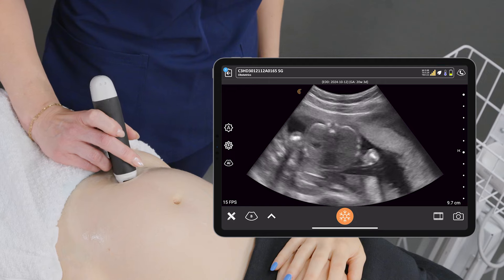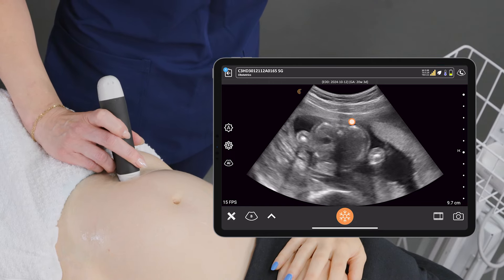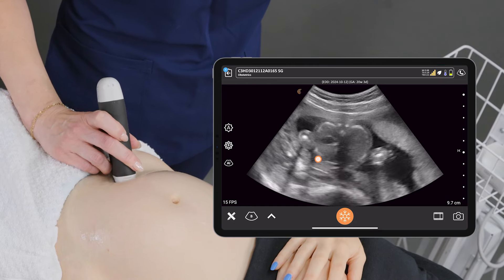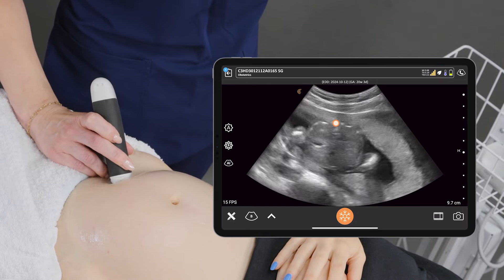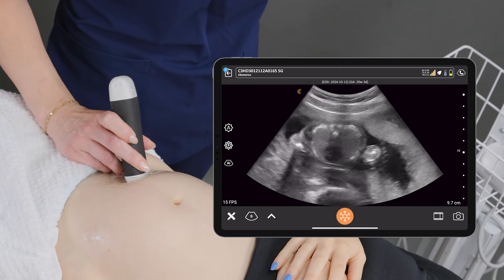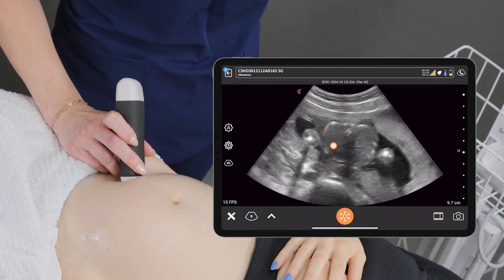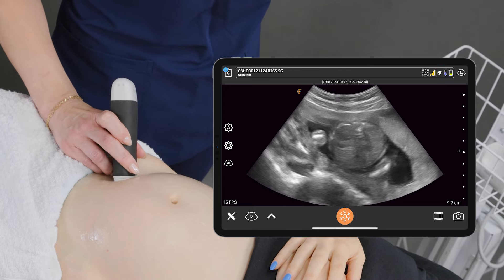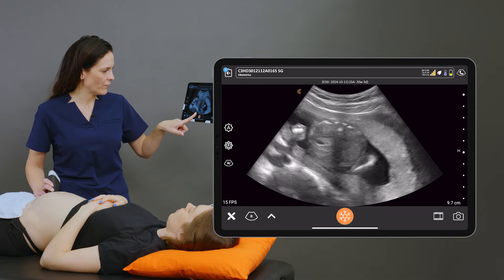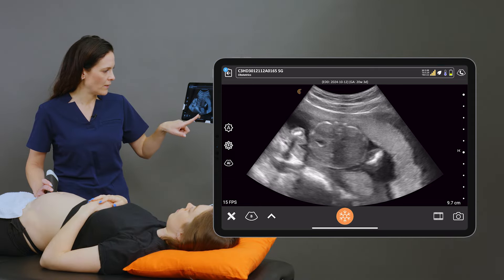I'm going to locate the abdomen in a transverse plane. I'm lining up the stomach and also the umbilical vein here on the baby in transverse, and when I'm happy with the image I can freeze it.